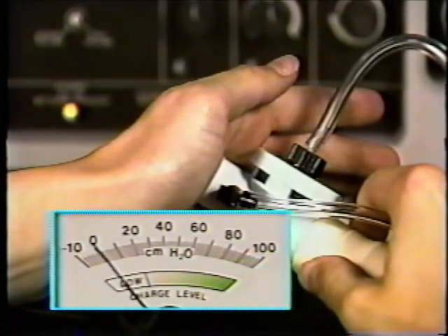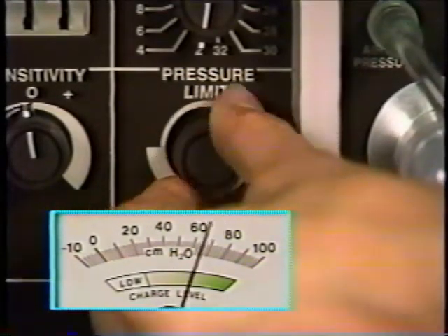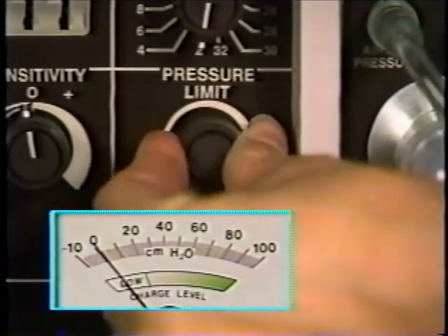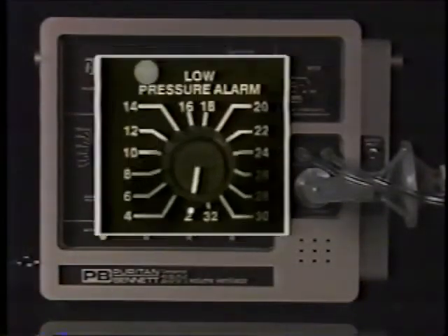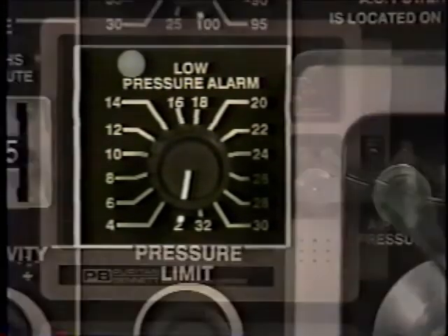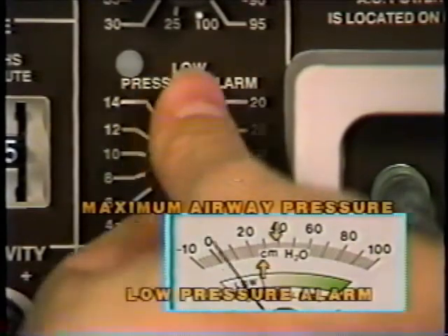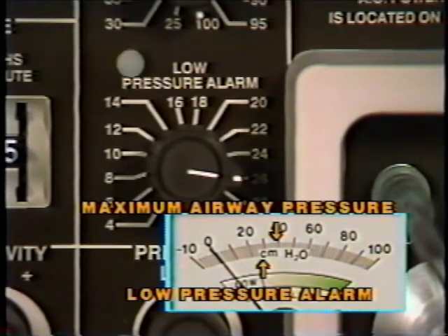When a specific pressure limit is prescribed, turn the pressure limit control counterclockwise to achieve the prescribed pressure limit setting. Any excess pressure above the pressure limit setting is vented at a port on the rear panel. The low pressure alarm is adjustable between the range of 2 and 32 centimeters of water. The low pressure alarm should be set below the maximum airway pressure, so that if a disconnect of the patient's circuit occurs, the low pressure alarm will be activated.